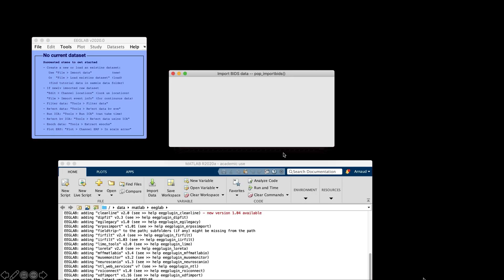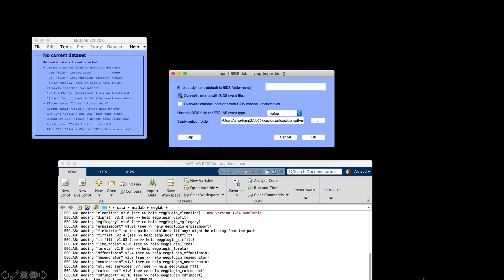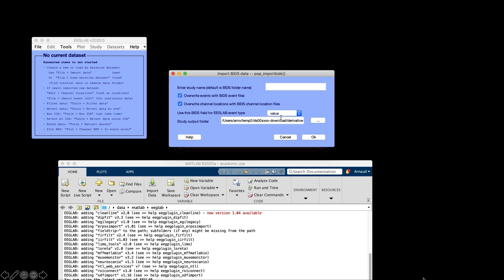So we select the menu, import, and here we're going to select these two checkboxes to override events. When these checkboxes are selected, EEGLAB will import the raw EEG data files, but will override the event and channel information with the information stored in the BIDS files. If the dataset you downloaded is well formatted in BIDS, it will rename events, add channel locations, and channel types. You may select the BIDS field you want to import to define EEGLAB data types. The two choices are BIDS event values and BIDS event trial types.